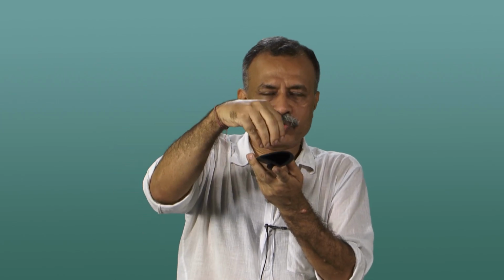So essentially on the test line, you already have a binder present. There are binders present there. So you have the antibody, and on top of that there are antigens. But these antigens are weak binders. So now when the flow is coming like this, it will topple all these weak binders and bind on top of them.